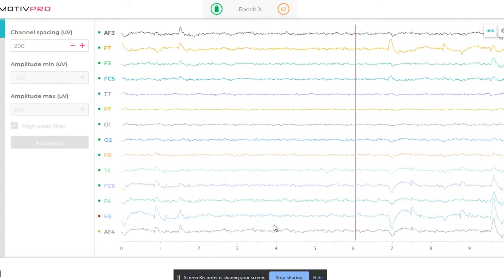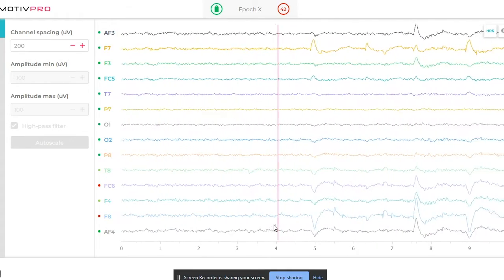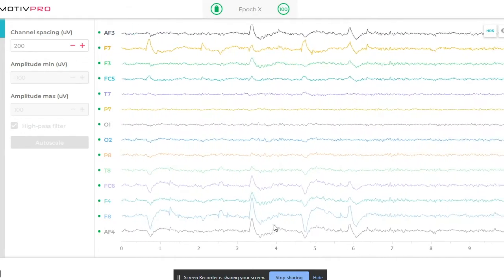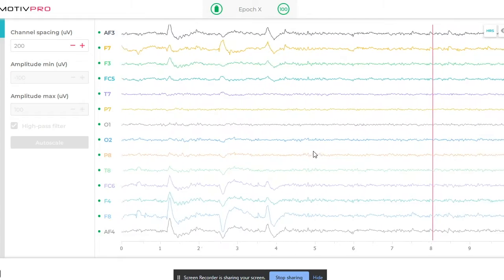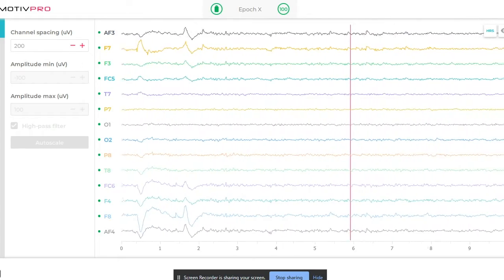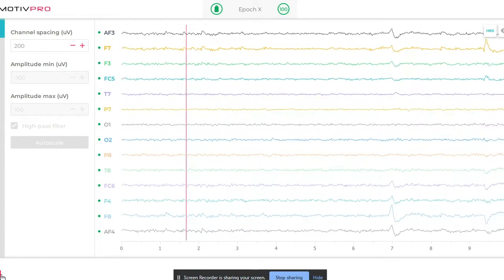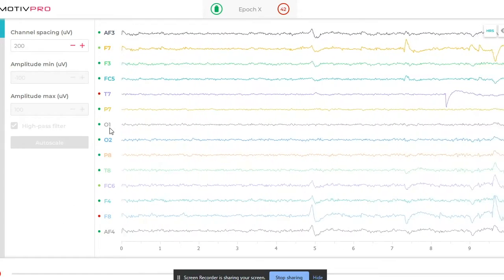These markers are apparent in the eMotive software and also stored as exportable data that could be matched up with EEG data outside of the eMotive Epoch and its component software. The EEG recording would then be stopped, and this additional information would be stored as well.